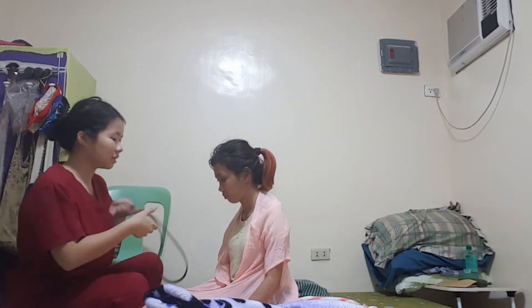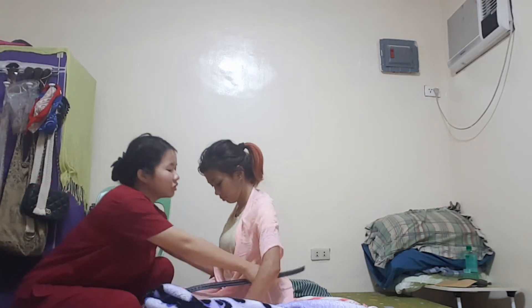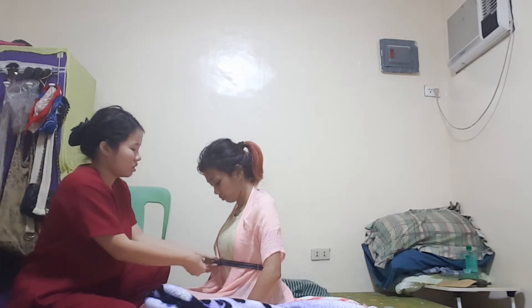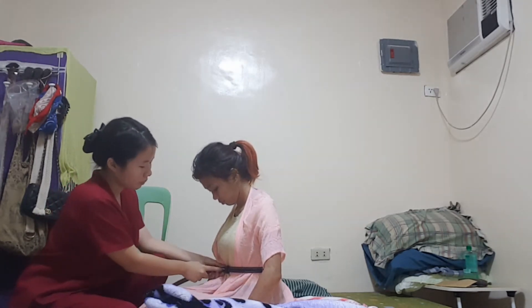Now for procedure number nine: place the gait transfer belt snugly around the client's waist. Check to be certain that the belt is securely fastened. This is to ensure client safety and comfort. I'm going to put it on the patient and check if it is securely in place.